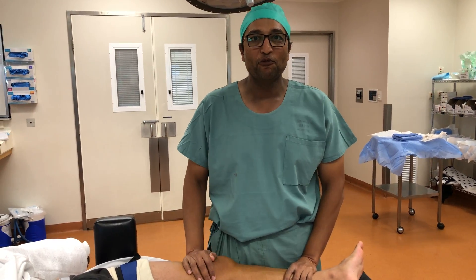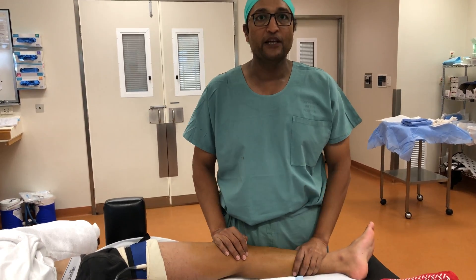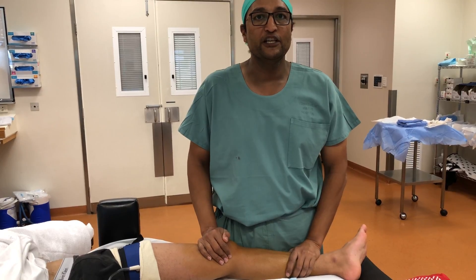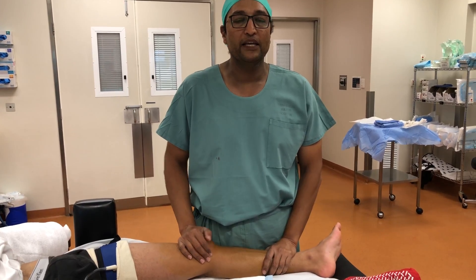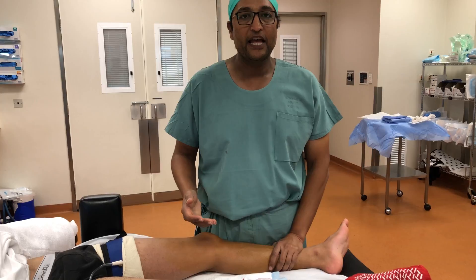I'm going to take you through what a locked knee looks like. Here's a patient I'm about to do an ACL reconstruction on. This boy had a twisting knee injury approximately two to four weeks ago. He rehabbed himself but unfortunately went back to play touch football again and his knee gave way again and his meniscus has ruptured.